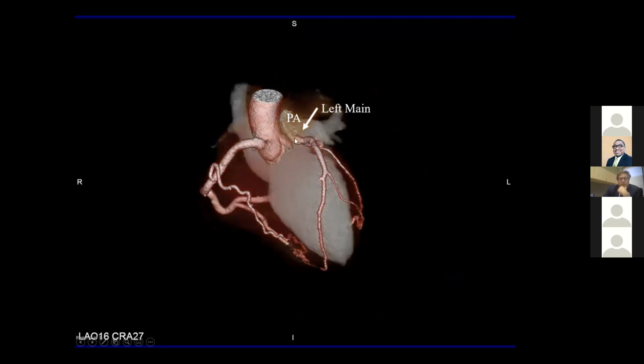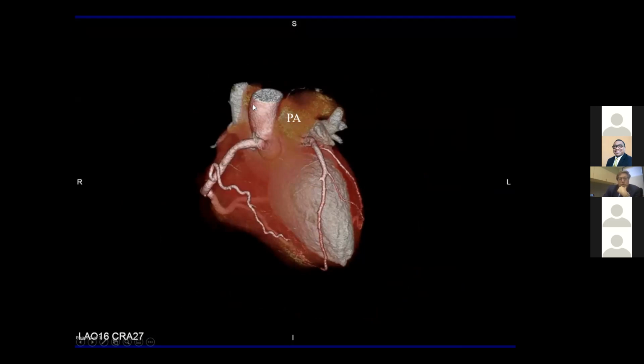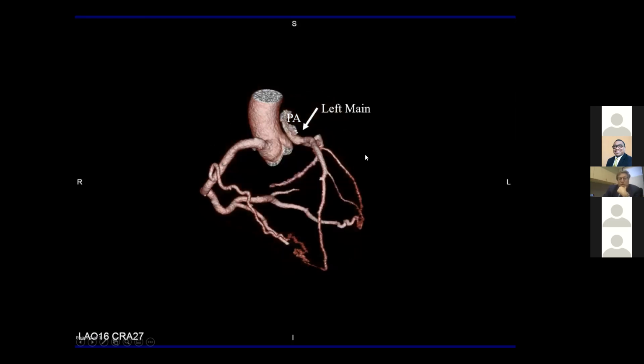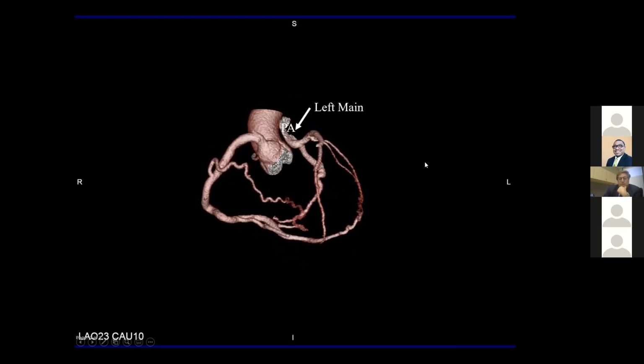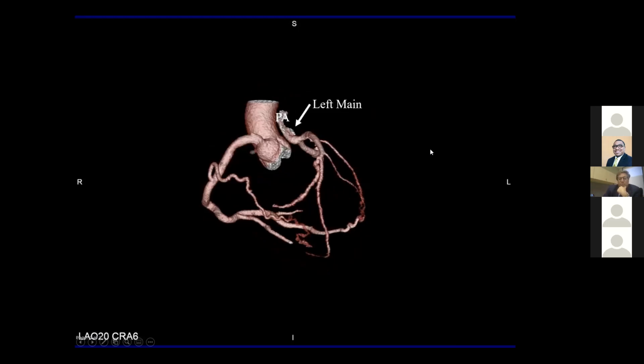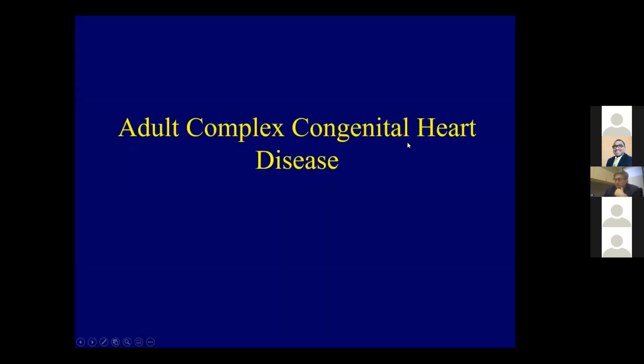Peel it back further, and now we have our diagnosis, and the surgeons know what type of approach they're going to need, what's going to be in the way, and what they're going to see when they do this. Again, while the patient's still at home before they've even come into the hospital to have the procedure done. And we can also get perspectives that they'd never be able to get in the operating room to get this three-dimensional analysis.